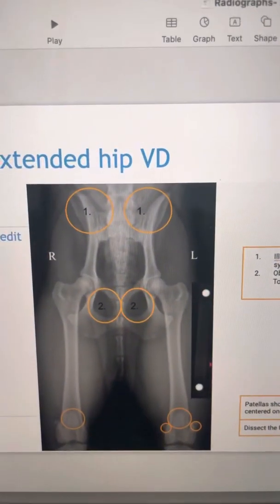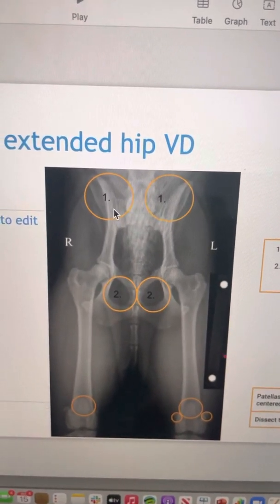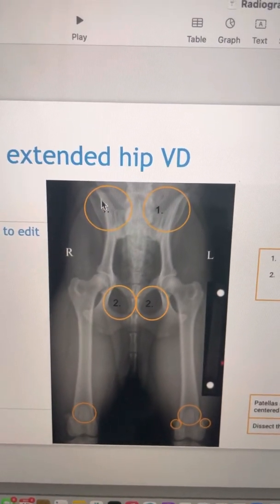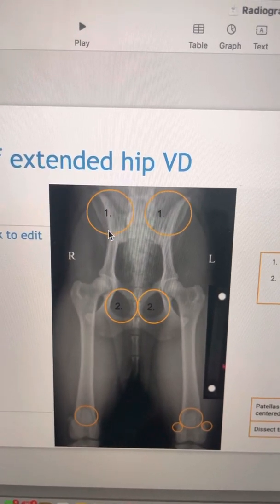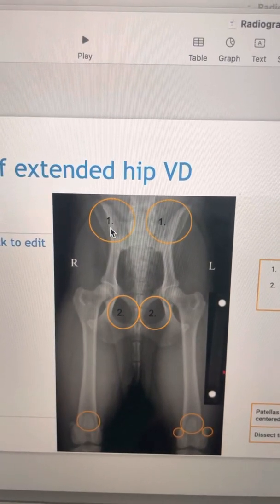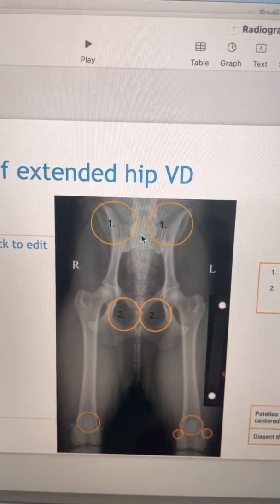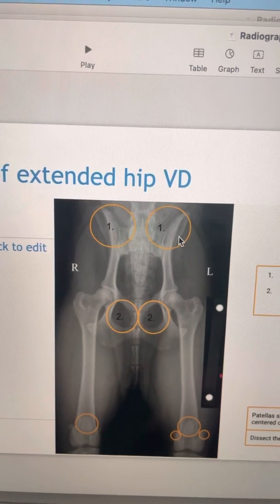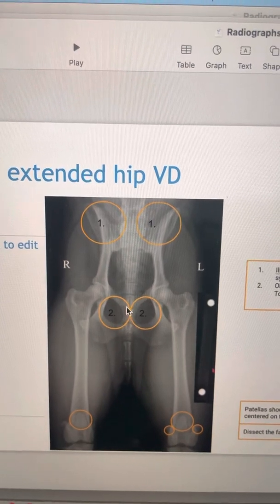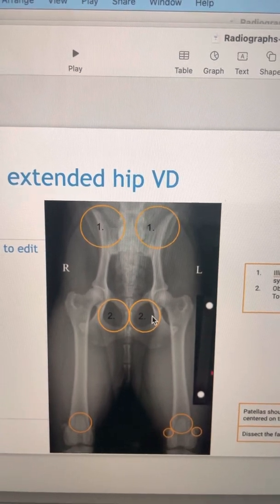So in this shot here, the things that are really critical on the VD view — most important is to make sure they're straight. I look at the ilia wings and I want to see that the distance between the sclerotic line, which is the top of the ilia wing — the ventral aspect — and the dorsal aspect of that ilia wing, is the same on both the right and left sides. That's one of the simplest ways to assess rotation. The other thing we can look at is the obturator foramina, and we want that to be uniform and symmetrical on both sides.